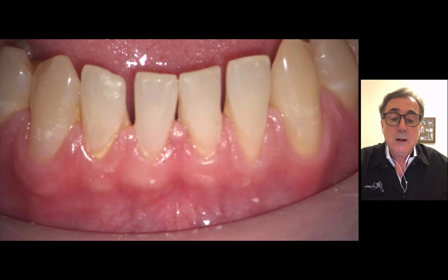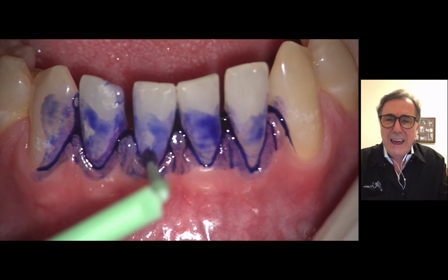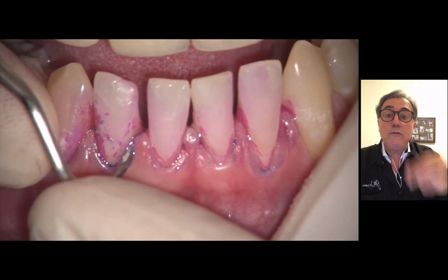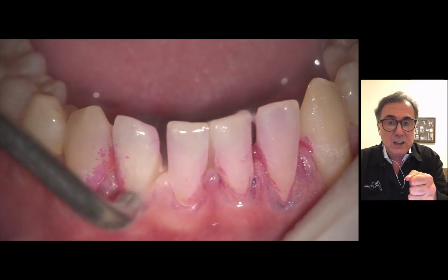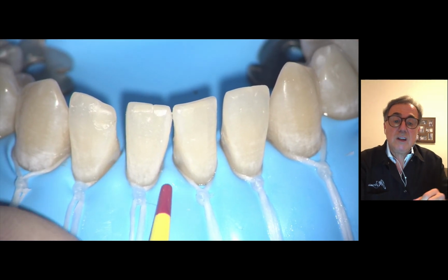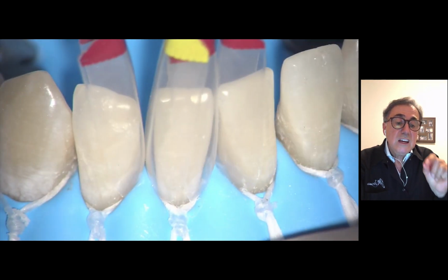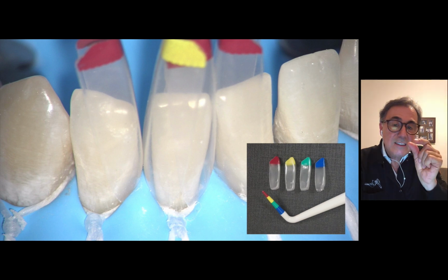Okay, so let's start. First thing we're going to do is disclose and remove all that calculus, all that plaque, remove biofilm, remove everything that stands in the way of a good adhesive restoration. Okay, so we need good adhesion, and to achieve that, first thing, clean your tooth. And then we're going to use rubber dam isolation, and this is a tool that comes with the kit, which is used to measure the space.